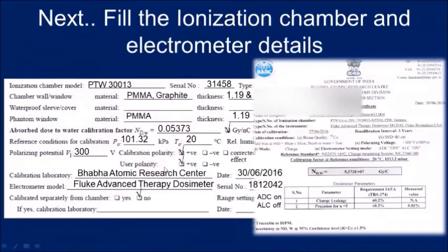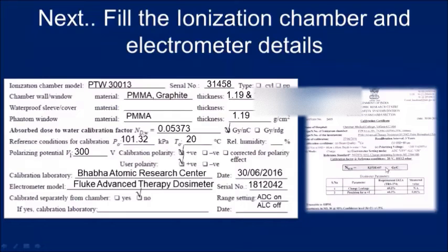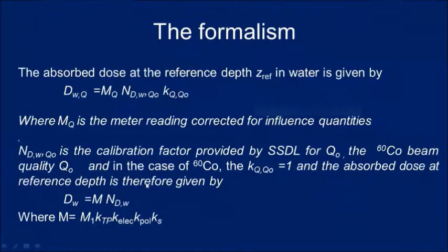The other thing you have to note is whether the range setting is the same as the calibration. So you see what is the range setting they used, and you have to use the same range setting here.